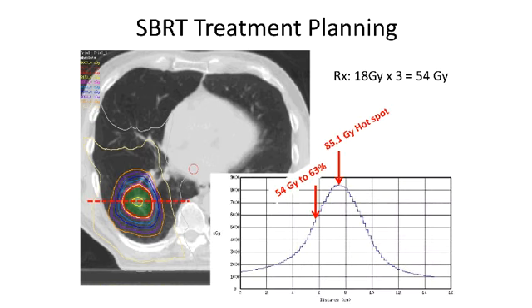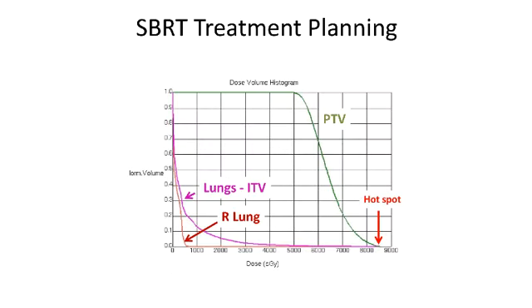So here's the line and here's the dose profile. You'll see we've got 54 gray to the 63% line, and then there's a hot spot in the middle, 85 gray at the center. The reason it's designed like this is to provide a sharper fall off for the dose distribution, and you can do that at the expense of having a hot spot inside the tumor.